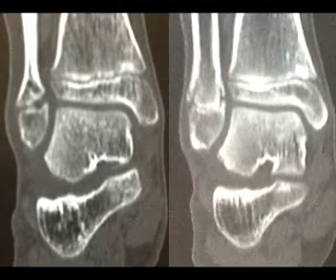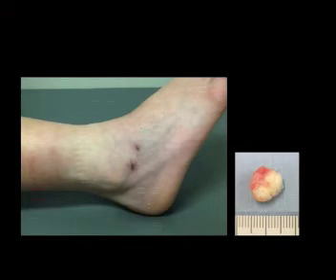No hypertrophic bone fragments or loose body remnants were observed on CT scans taken 1 month after the surgery.